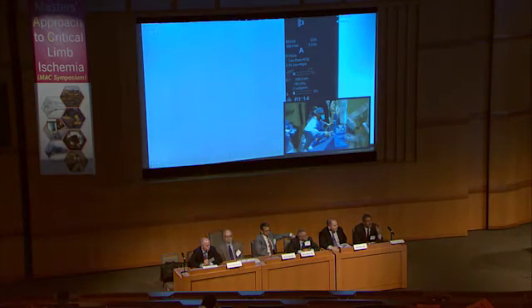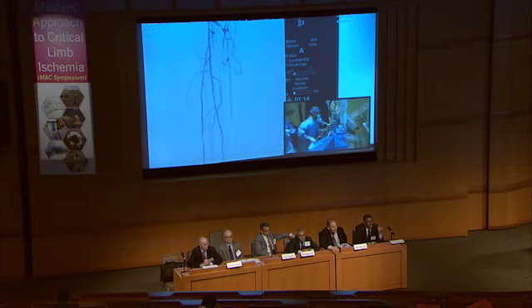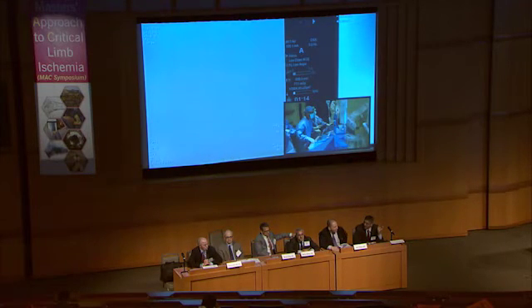Craig, you had a point, please go ahead. Actually, I agree with Thomas. I think we just need to do the SFA at the end, but we can get the tibial vessels open completely. Go ahead, Craig.